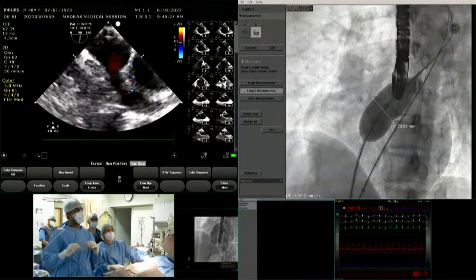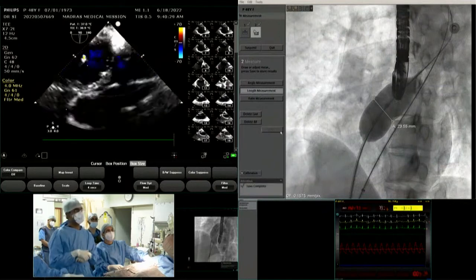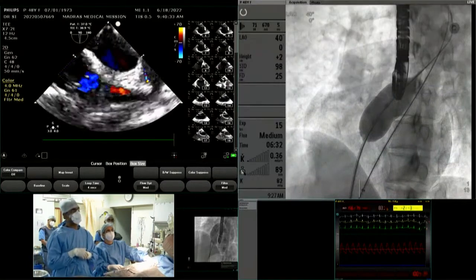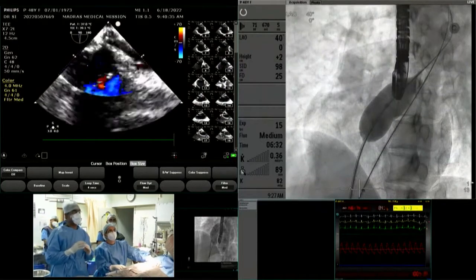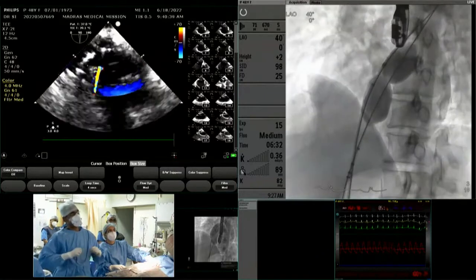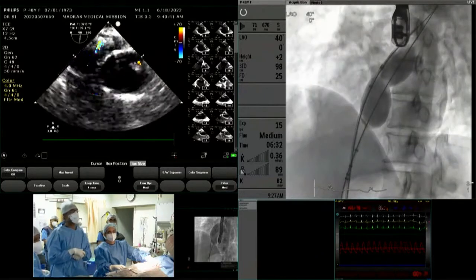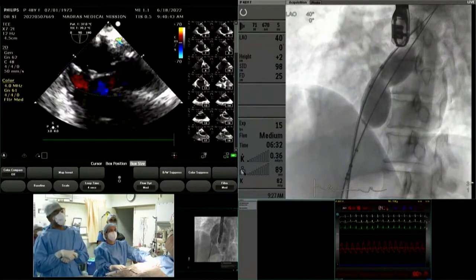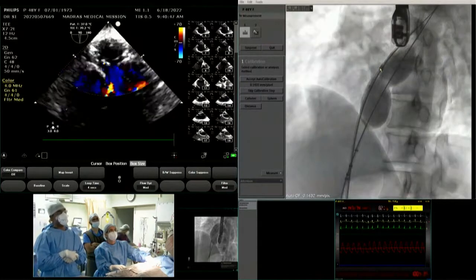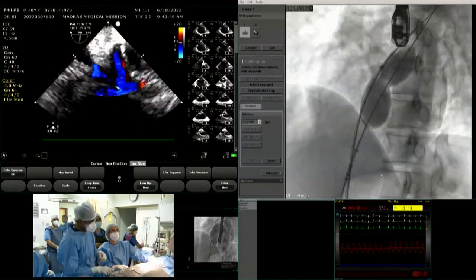Yeah, now go inside, that's the right upper pulmonary vein. Little rightward, get the superior vena cava. Yeah, yes. You are now in the superior vena cava. Now just push the cable, now rightward and leftward rotate. We are not finding a very significant blue color across. So we assume that these are the only two defects.